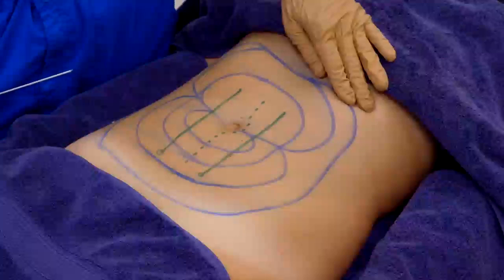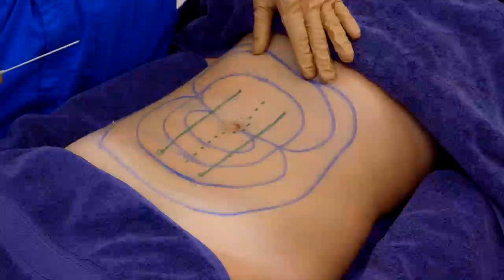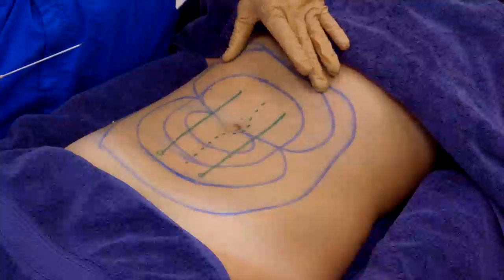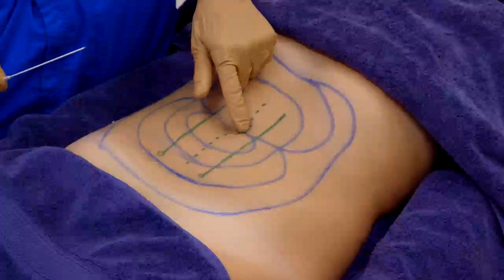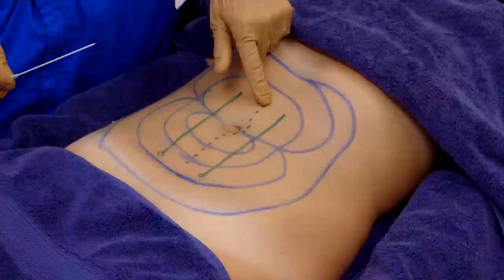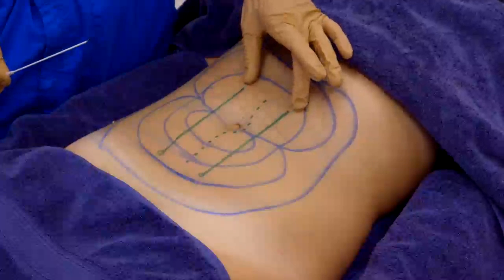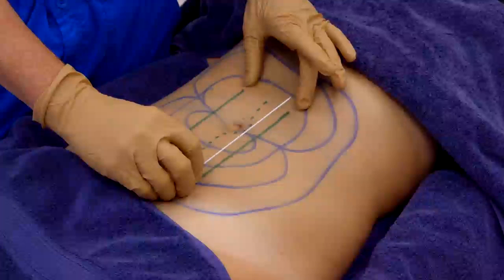In this patient, I've pre-marked a series of blue concentric topographical markings in order to show you the relative depth of the subcutaneous fat. This dotted green line indicates the theoretic proposed surgical site incision for an open abdominal procedure, and the solid green lines indicate the path that I will insert the subcutaneous catheter.